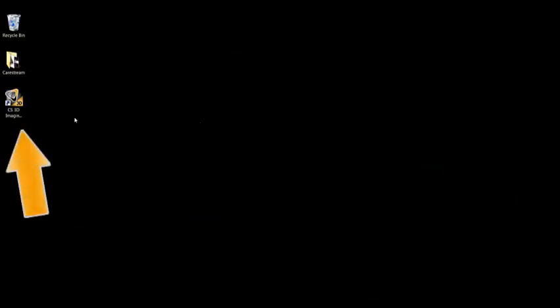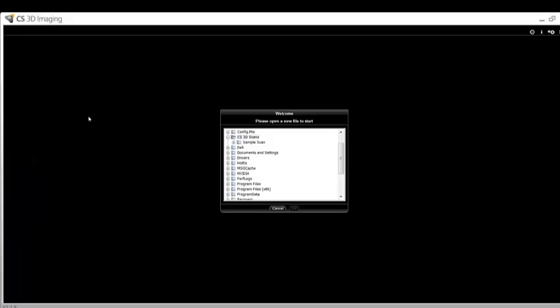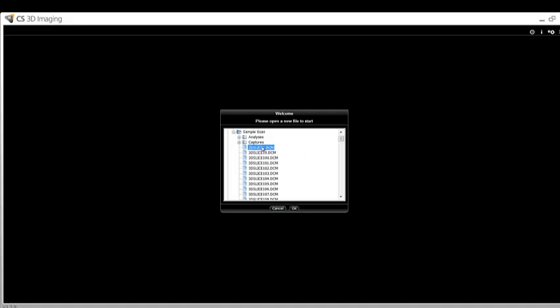To begin, we will open the CS3D Imaging software by double-clicking the icon on the desktop. You will then be asked to browse to the location of your patient's scanned data. Click the plus sign next to the main folder to expand it, single-click to highlight the first slice of the scan, then click OK.